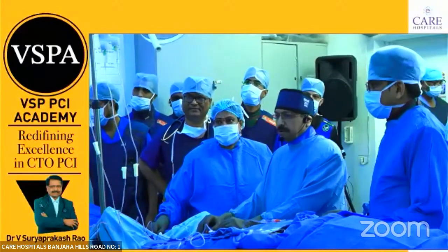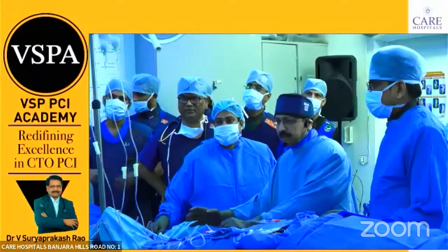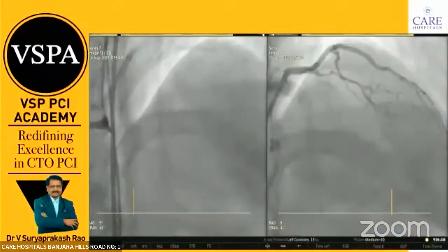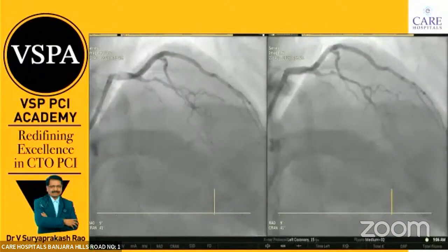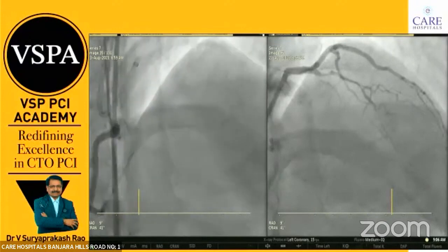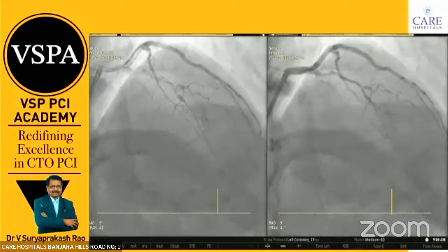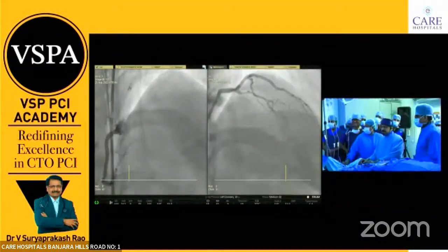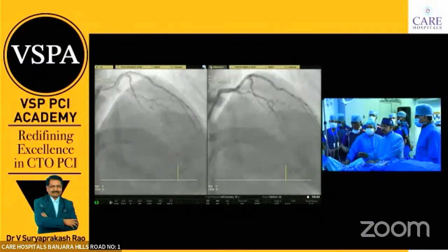Anyway, the strategy here is mainly antegrade because the retrograde collaterals are hardly seen and there are no good exit and entry points. This is always the assessment in a dual injection. Fellows and attendings, I again emphasize that the dual injection gives the length of the lesion, the tortuosity, the collaterals, the distal vessel size and the calcium. These are the points we have to assess in the dual injection. Then the strategy should be decided.